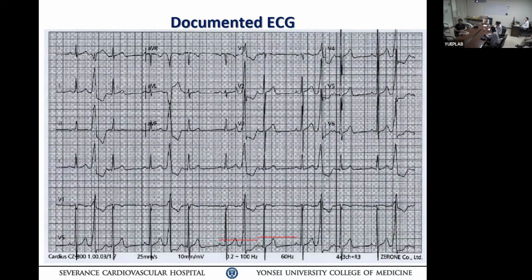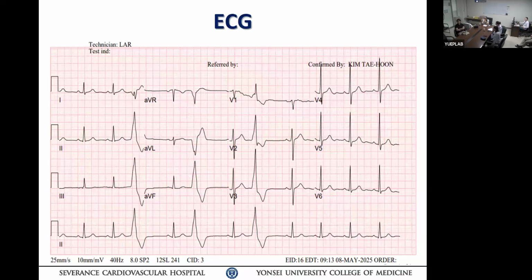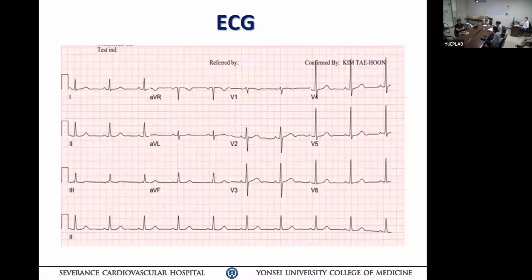Another important message: if you dissect, you see this flushing of the contrast, where you think it's in the fat tissue, but it's not in the vein. These veins are protected by the fat tissue. Remember the anatomy? That is important. And you seldom stay in the pericardium. It's like a flower, right? So that is basically cardiac extravasation, compression of that fat tissue, compression of the vein. So wait there, observe.